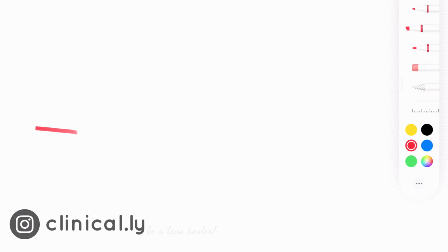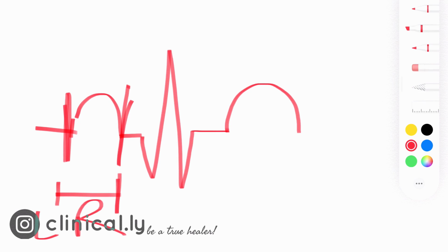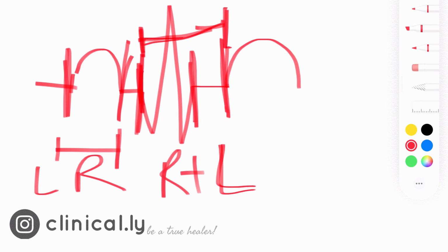So now we know the formation of the P wave, the formation of the spiky QRS complex, and the formation of the T wave. We also know the duration of the P wave is the time taken for the activation of complete left and right atria. We also know that the duration of the QRS complex is the time taken for the activation of the complete right plus left ventricle, and right from the beginning of the activation till the beginning of the T wave, the cardiomyocytes remain activated. That is, they remain in the plateau phase.